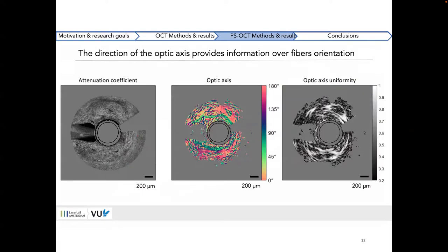Yes. Thanks for asking. So now we can color code for the actual direction of these fibers.